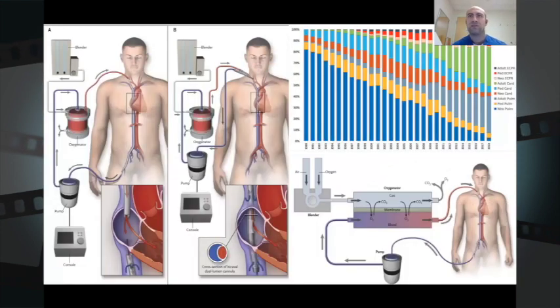So these images, I just wanted to introduce ECMO as a whole for some of you that may not be familiar with it. Basically, the diagrams are from a very recent publication by Gattinoni and his colleagues in 2020 in Anesthesiology, and then a very good narrative review in the New England Journal from Brodie and Bacchetta from 2011.